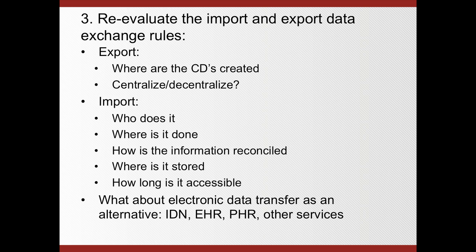Then of course you will never take a CD and just upload the data from the CD straight into your PACS system, because there could be a potential conflict, particularly with the patient name, the IDs, and some of the identifiers that you use in your own system. The identifiers that are typically used in your radiology department will be an accession number, for example. So you want to make sure that you reconcile the data that is imported with the data from your PACS system, so there's no potential conflict.